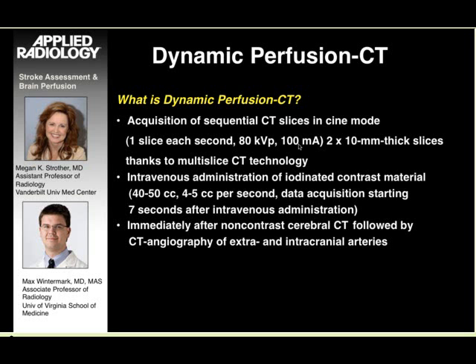You are going to be able to reconstruct those time density curves in each pixel of the brain, and then you are going to use a perfusion CT software to extract some perfusion information from those time attenuation curves. So a very different technique, a very different approach.